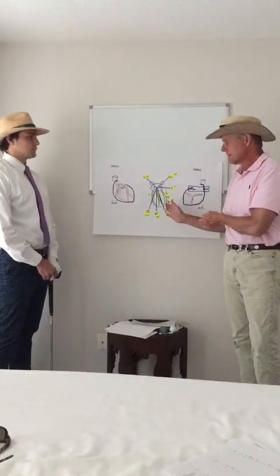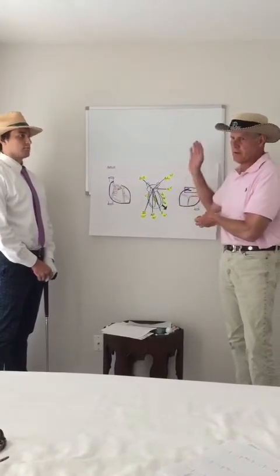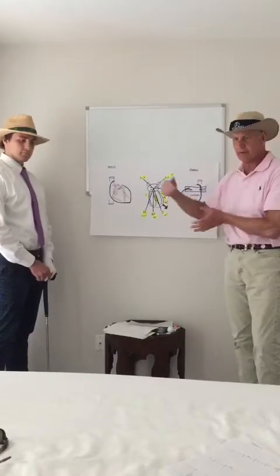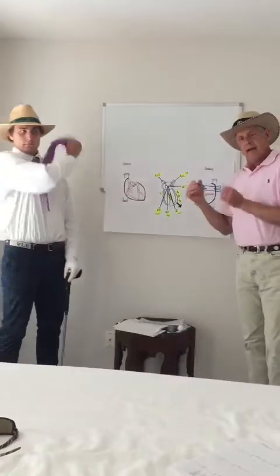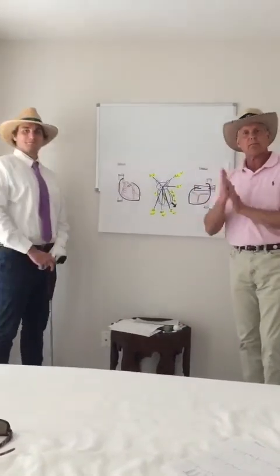You'll know if a patient has RVH. You'll know if they have LVH. You'll know if they have strain. You're going to be able to look at the polarity of the T waves using Will's tie in the next segment. And you won't have to memorize much at all.